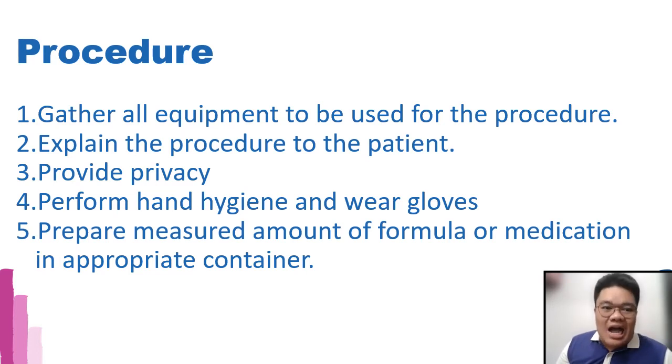So class, you ask your patient to state their name. Okay, you ask the patient to state their name. So class, it's just like this. You hold the patient, you ask the patient, ma'am, can I hold your hand? I would just be checking your ID band. And then class, ma'am, please state your name. And then you compare what she's saying to the ID bracelet and to your patient's chart.